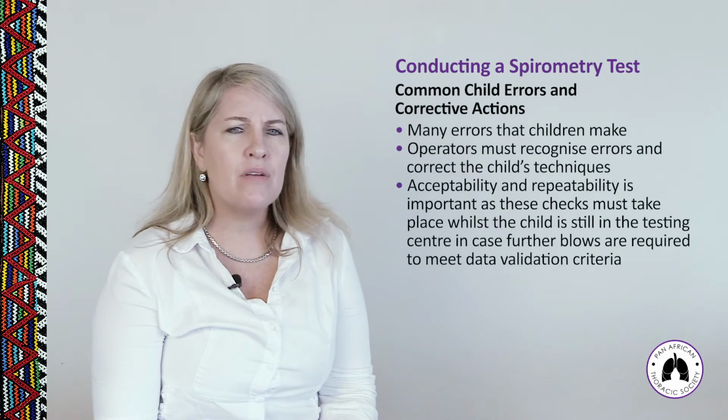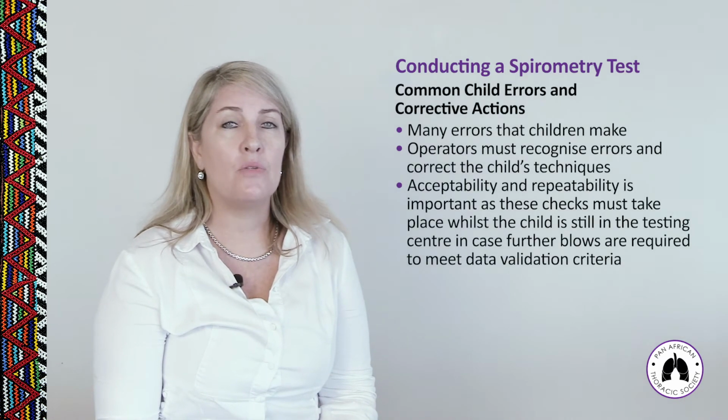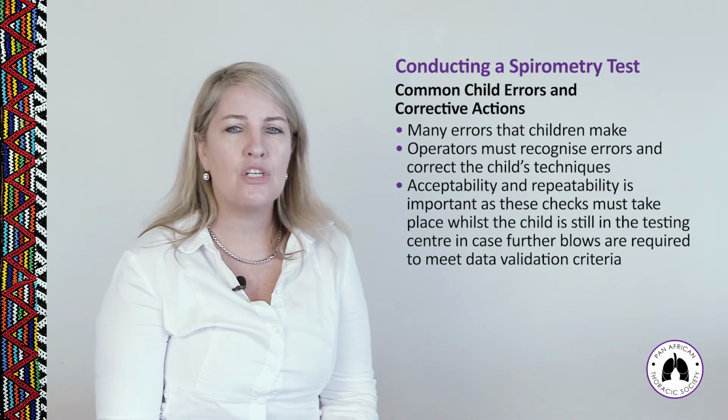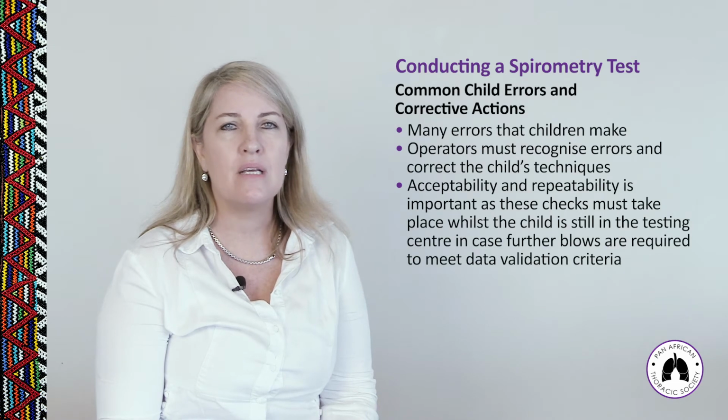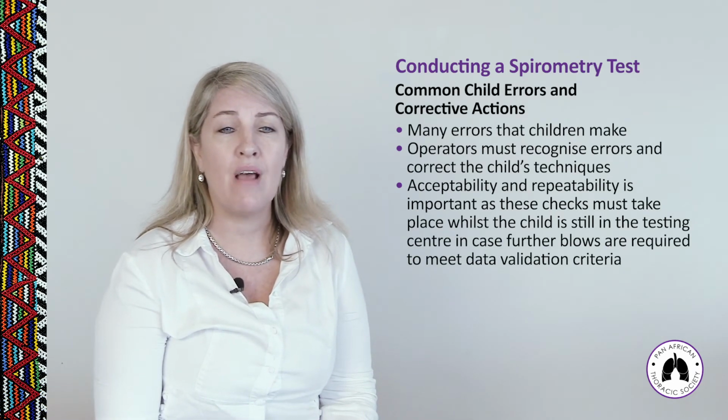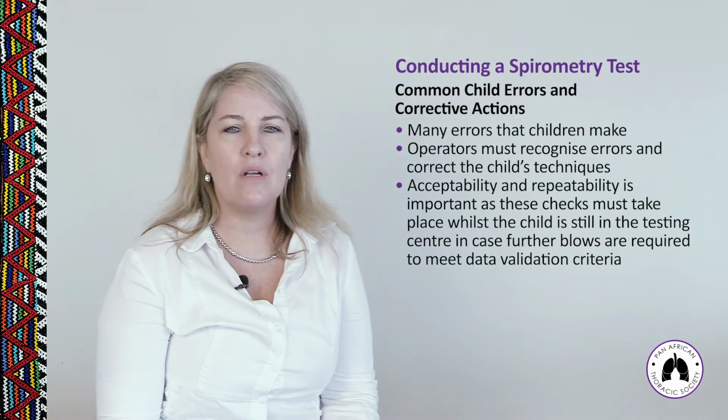So there are many errors that children make on a regular basis when conducting spirometry tests. It's very important that the technicians are able to recognize these errors and correct the child's techniques to ensure that the data is valid. So let's have a look at some of these.